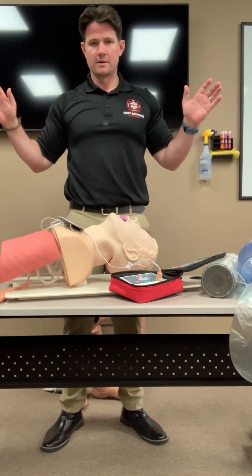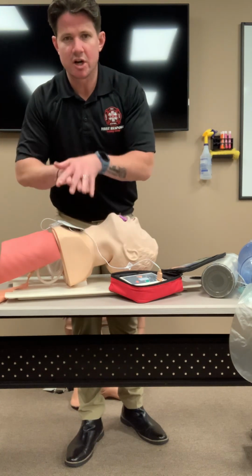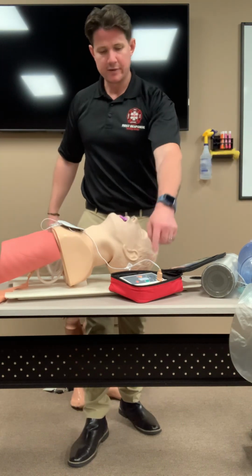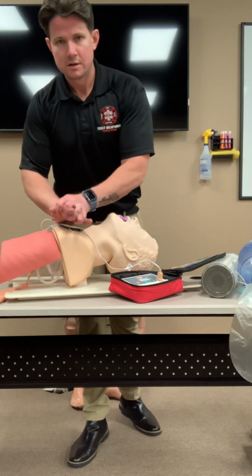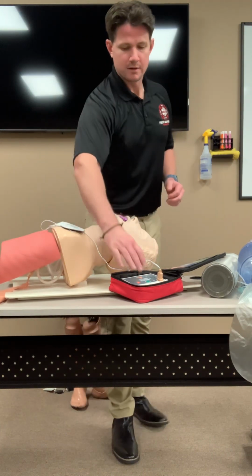Shock advised. Charging. Continue CPR. When it says charging, we go back into CPR. Stay clear of patient. Now it's charged. You're clear, I'm clear, we're all clear. Deliver shock now. Press the orange shock button now. You're clear, I'm clear, we're all clear. Shock delivered. Begin CPR again.